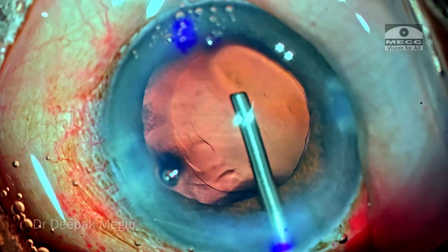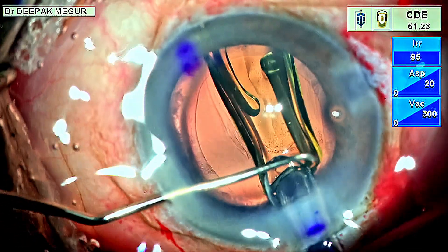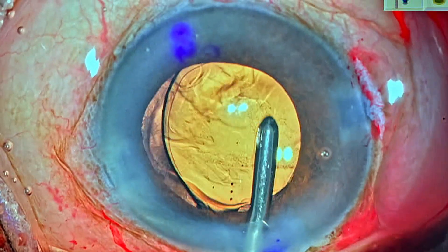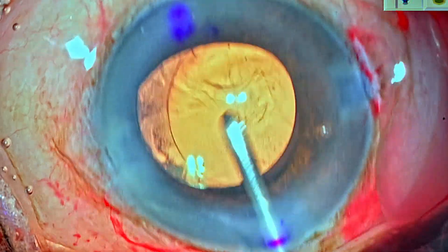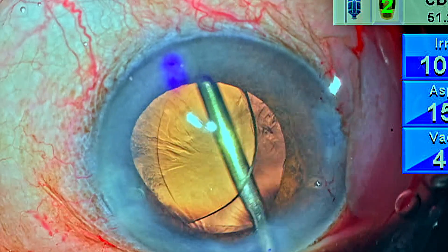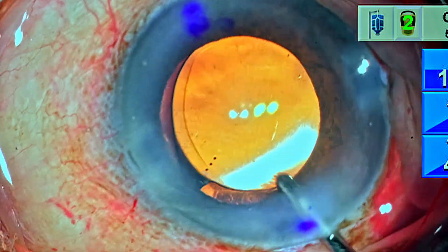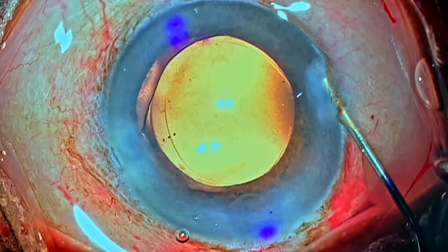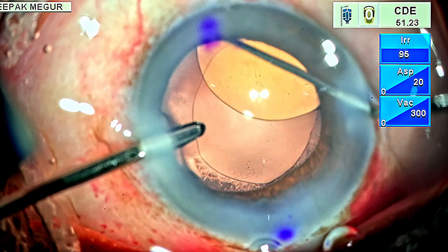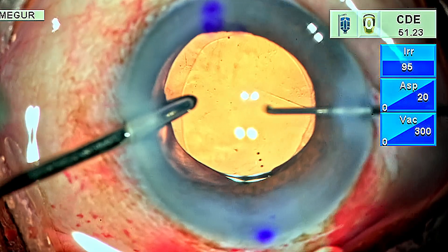Time to implant the lens. OVD is placed into the bag and the lens is loaded and implanted. There is a common misconception that for toric IOLs you must use only hydro-implantation — it's not mandatory. You can remove all OVD from behind the lens before aligning it properly. Using a viscoelastic is quite safe and it's not difficult to remove the OVD from behind the lens. The lens is finally aligned to the preferred axis.